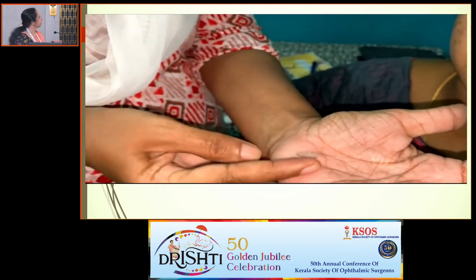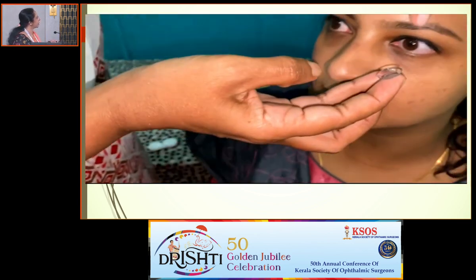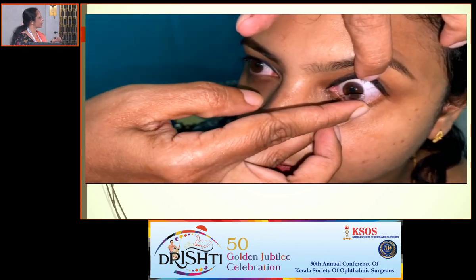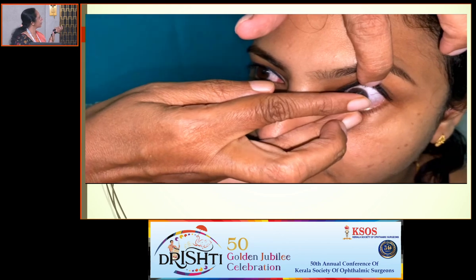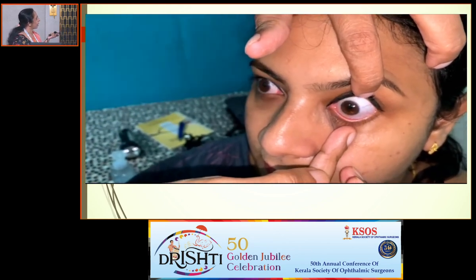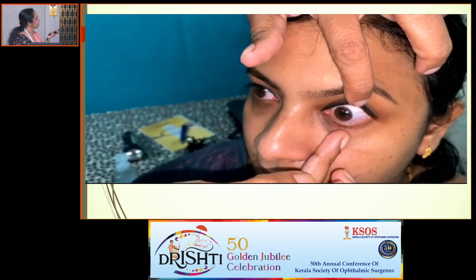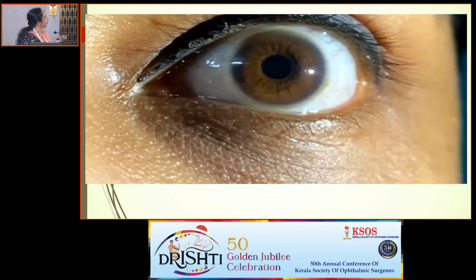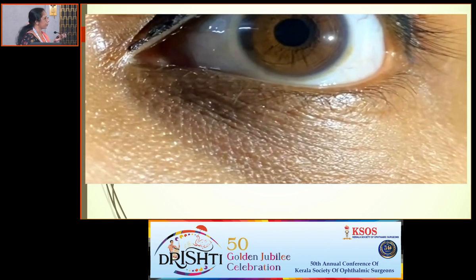Now the contact lens is placed with a trial lens, you can use this. Here the refraction of the patient was -2 diopters, but this is done with a -1 diopter contact lens. You insert the contact lens and see whether the patient is comfortable. Ask the patient to move along. See whether the patient is comfortable and look for the centration of the contact lens.